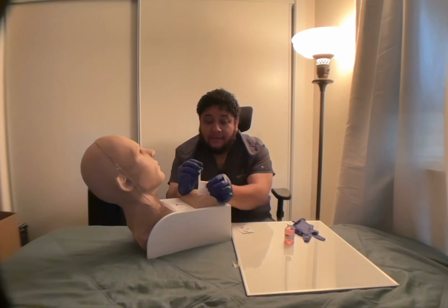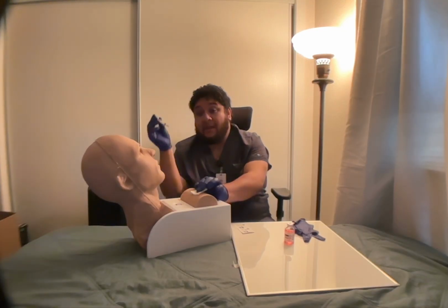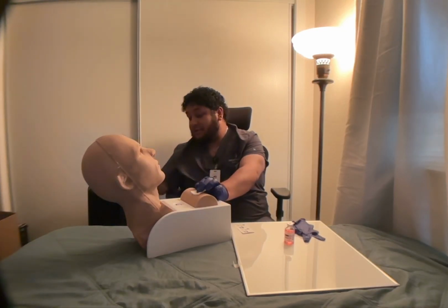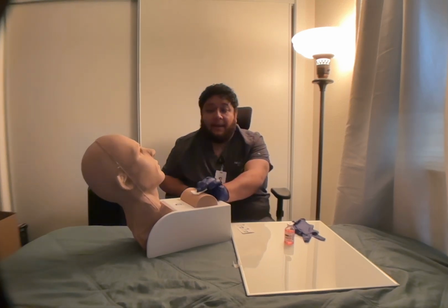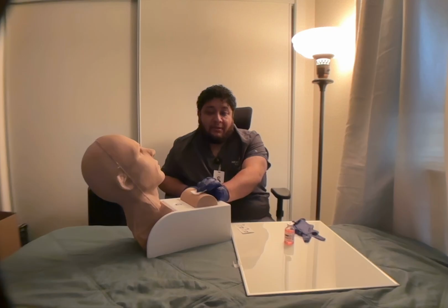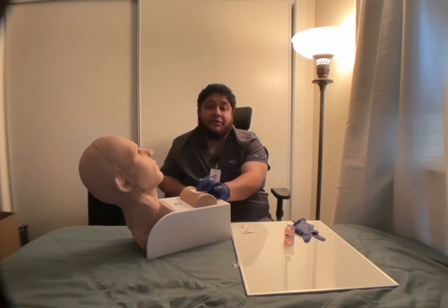Now I'm going to take gauze, slowly remove the needle, and gently apply the gauze over. I will now discard the needle into the sharps container. I don't have one, so I'm just going to place it down in a bucket. I'm going to hold the gauze here just for a little bit, just to make sure. Once I'm done, you want to make sure you don't rub the gauze or apply too much pressure.